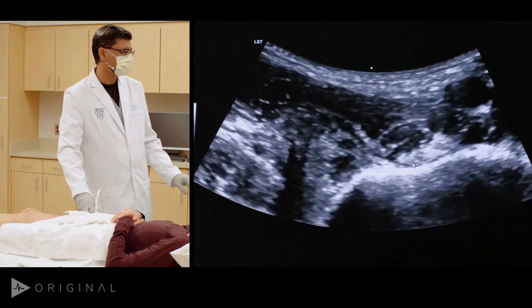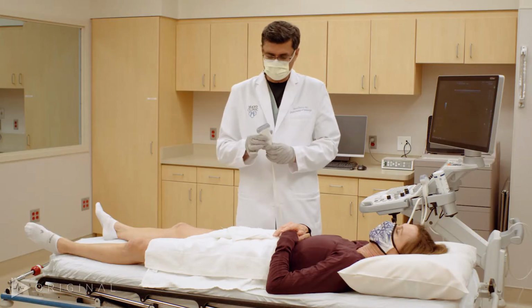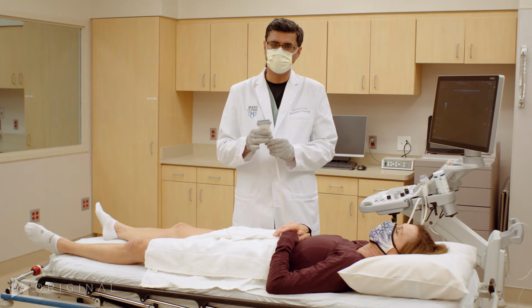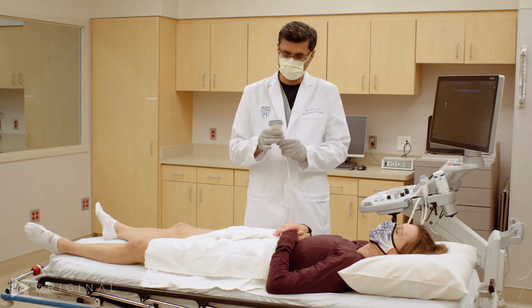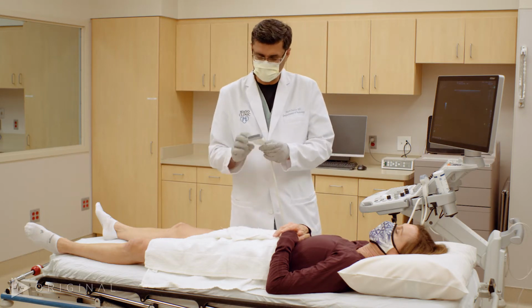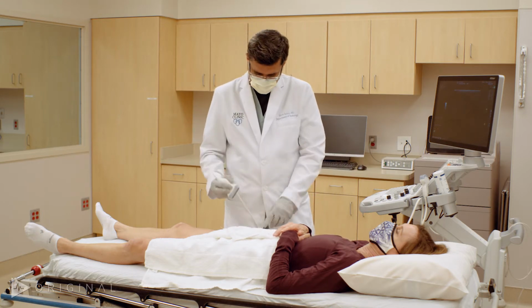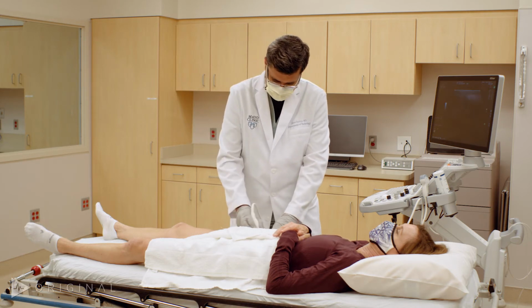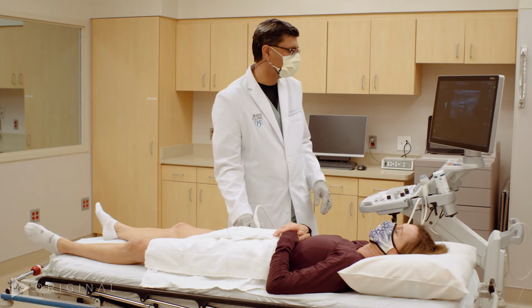So what we've done now is we've gone to the ML615 linear transducer. We're going to try and use this to look at the proximal insertion of the sartorius muscle at the anterior superior iliac spine. So in a longitudinal way, you can always palpate where the anterior superior iliac spine is, and then keep the transducer right there.